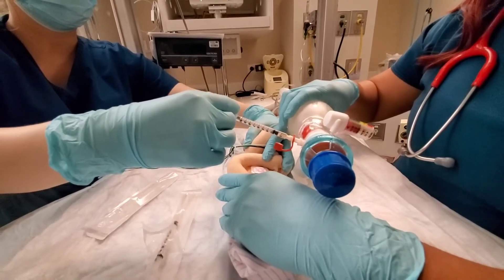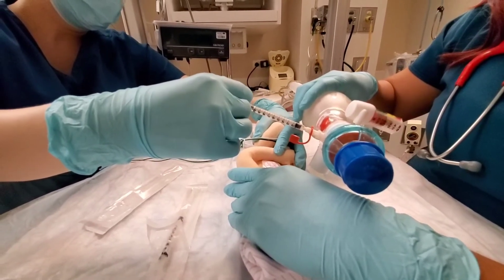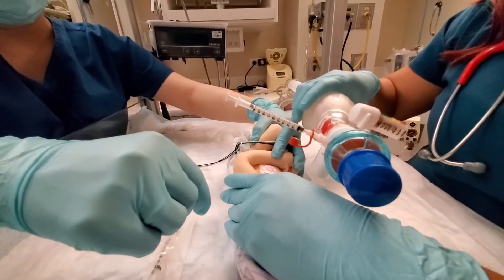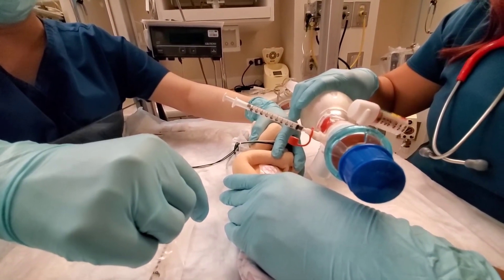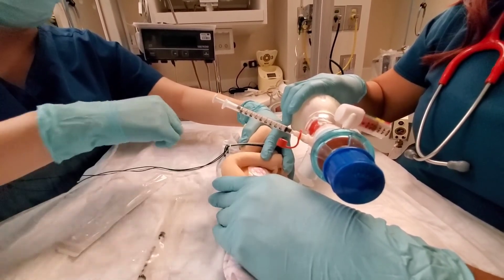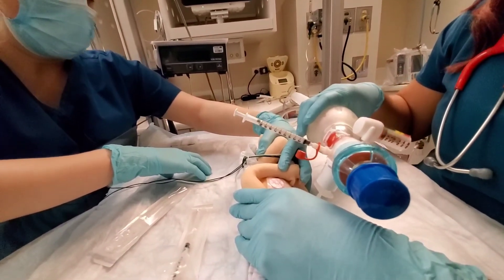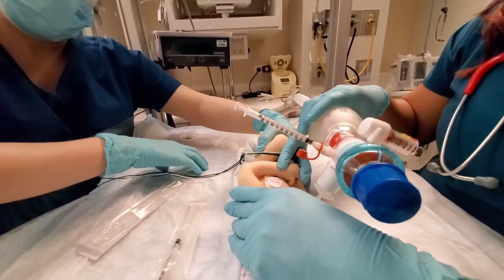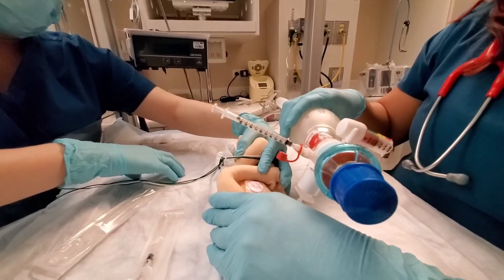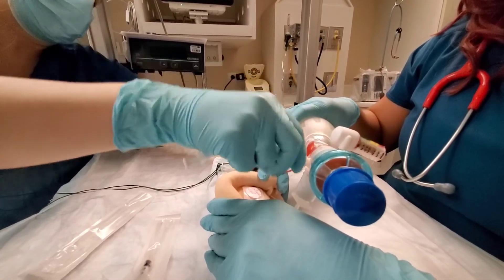A couple of things that could happen: if the heart rate started to fall, we would actually do a couple of things. First, we could stop giving the medication. Second, we could increase our PIPs. Third, we could also increase our I-time. Those are the three easiest things to do. The InfaSurf is in and we're waiting 30 seconds. For whatever reason, if none of those things work and the baby still has a low heart rate, we would actually — and this would be our last method — pull the surfactant back out. But that would be our very last choice.